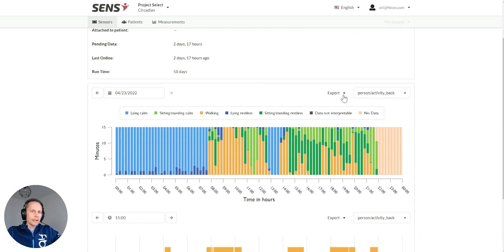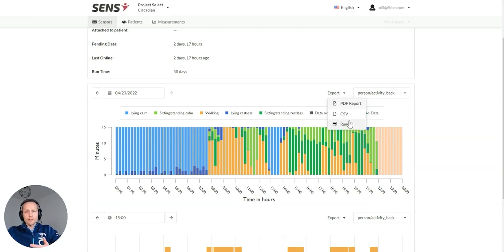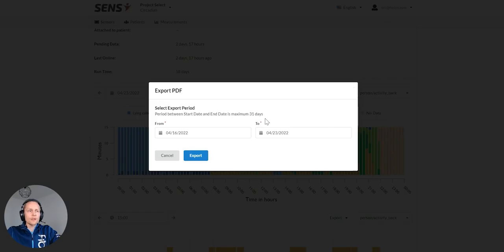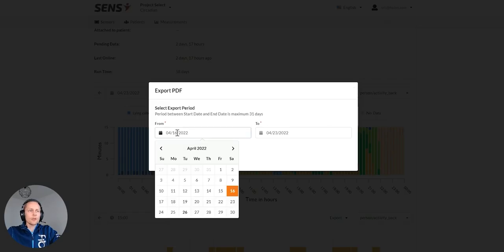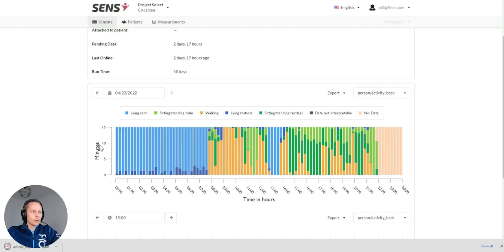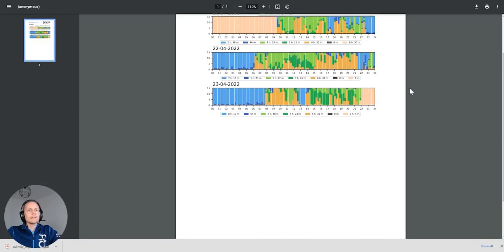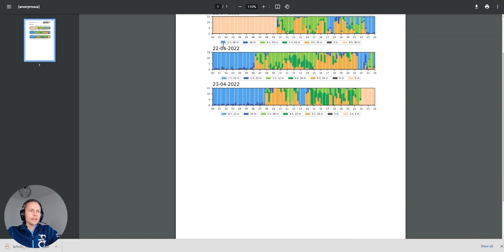So I can look at the data. If I want to go and export the data, I can export it in CSV, which can be opened in Excel. If I want to just get the PDF report, I can put here the dates I want. So that was when it was being measured.